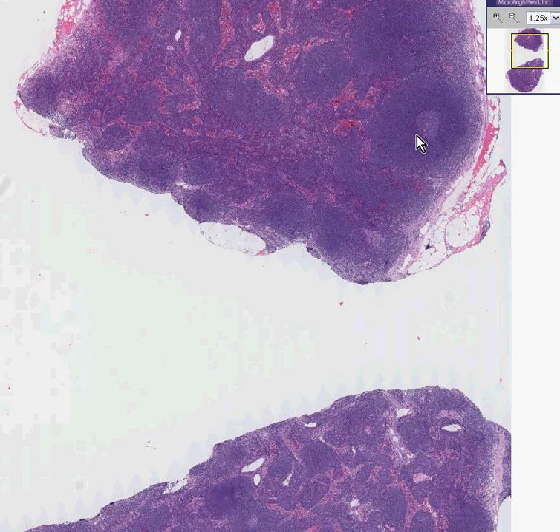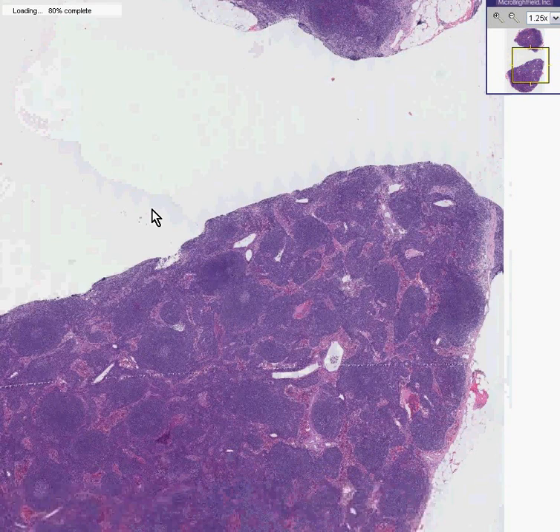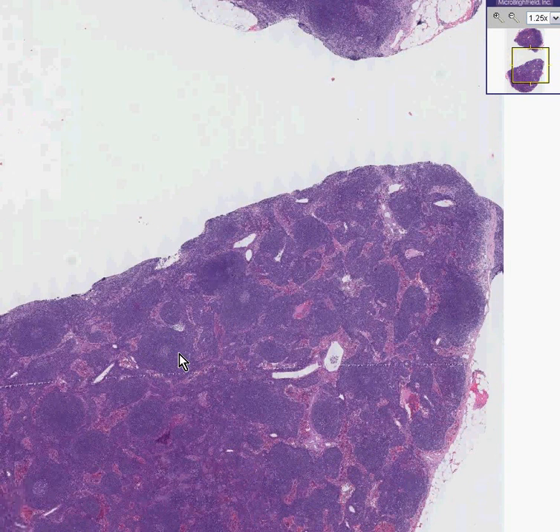They're B cells, and in mantle cell lymphomas — which are B cell lymphomas if you want to be more of a purist — these areas surrounding the germinal center are proliferated. That's why the overall lymphoma has a nodular appearance.